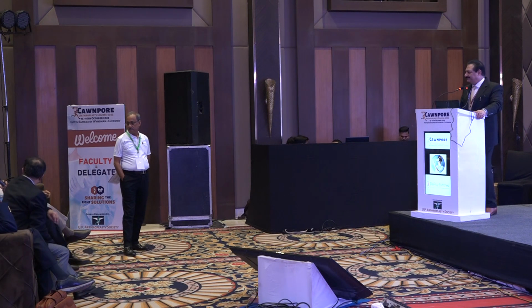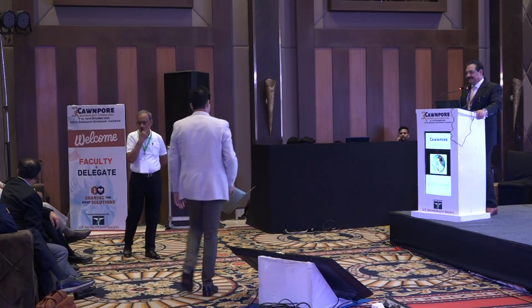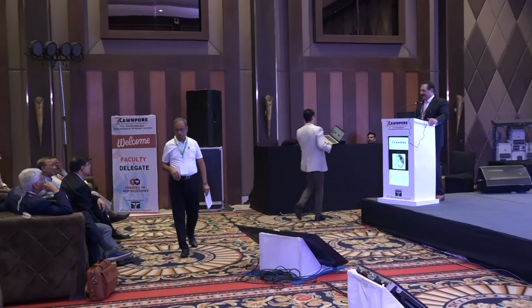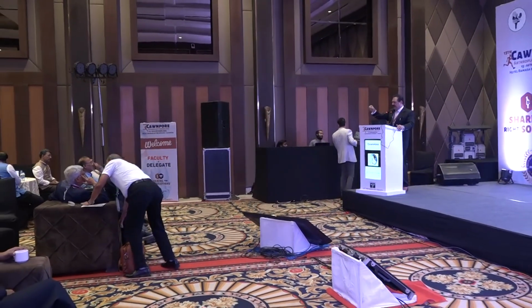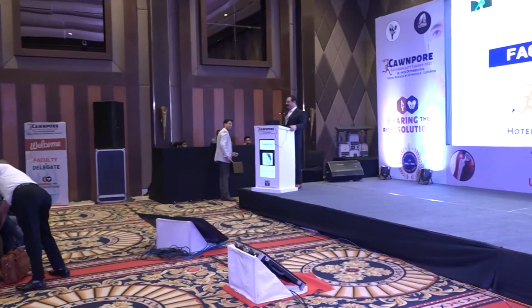Okay, Kapil, I'll show you a small video of how to expose the acetabulum. In lateral approach, if I find it difficult, I take slightly more exposure. It doesn't come in my way and I can close the cup.